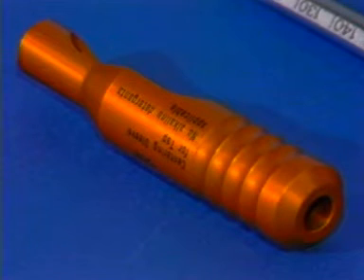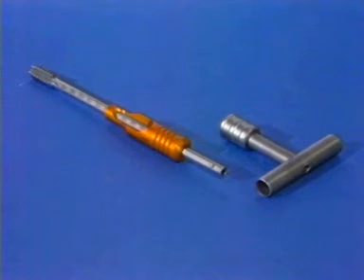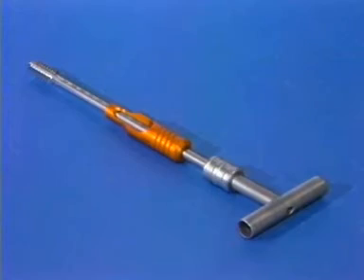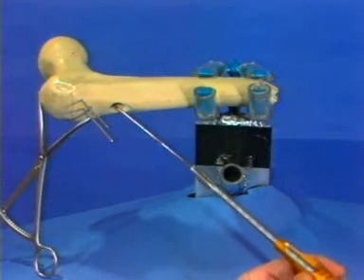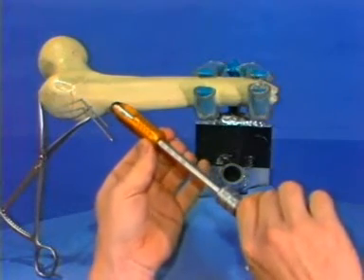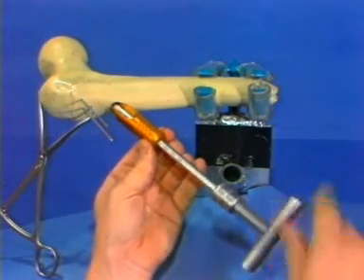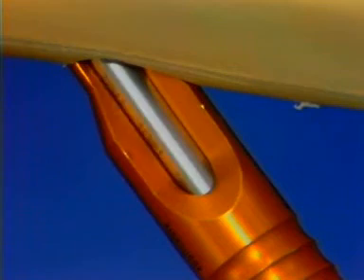For this purpose, the short centering sleeve for the tap, the tap and T-handle are selected. The centering sleeve for the tap is placed over the tap and the T-handle is connected. The tap is now placed over the guide pin and the centering sleeve is pushed firmly into the drill hole. The hole is then tapped to 110 millimeters. The depth of the hole is shown by the markings on the tap.